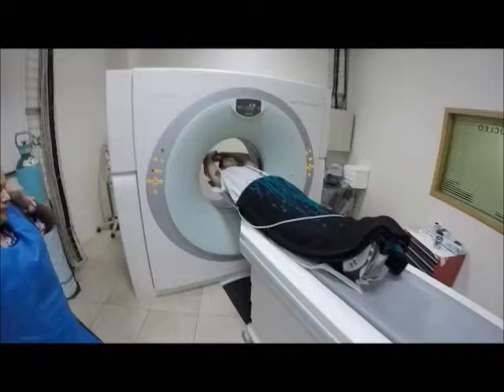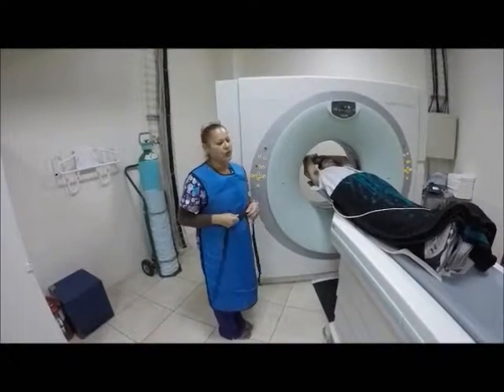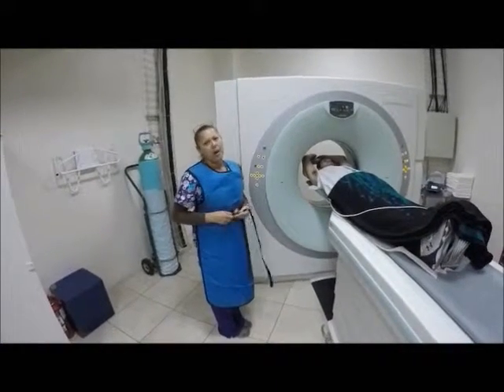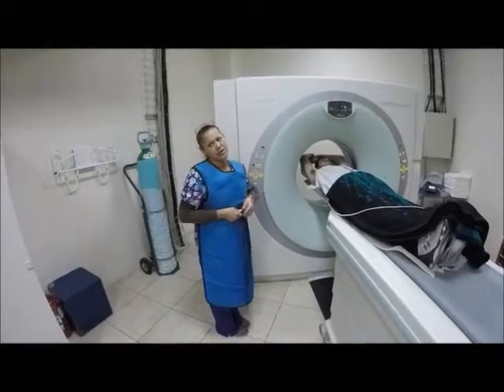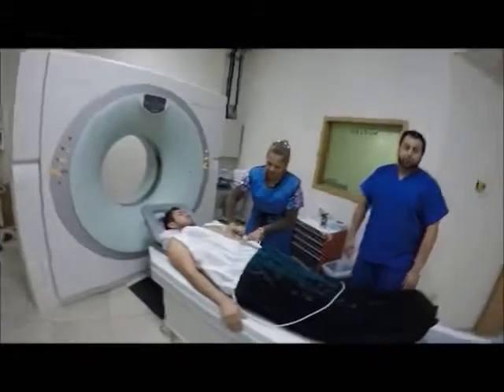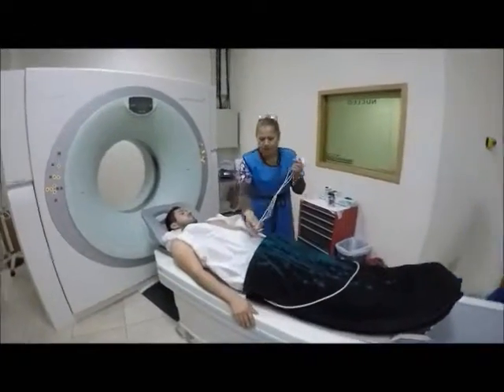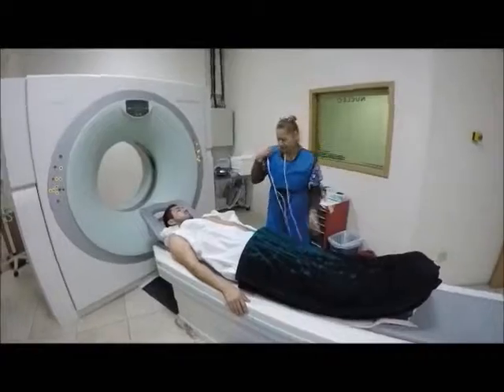Next, the table will move quickly through the scanner to determine the correct starting position for the scans. Then the table will move slowly through the machine as the actual CT scanning is performed.